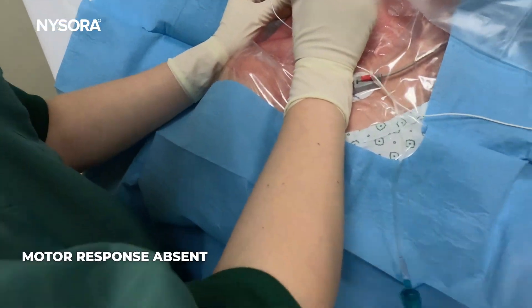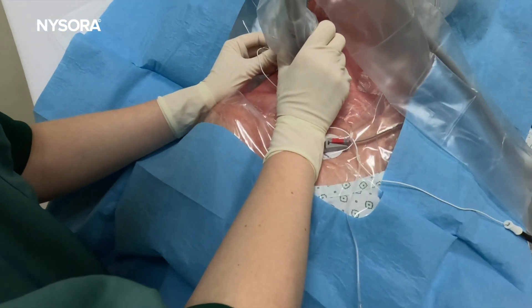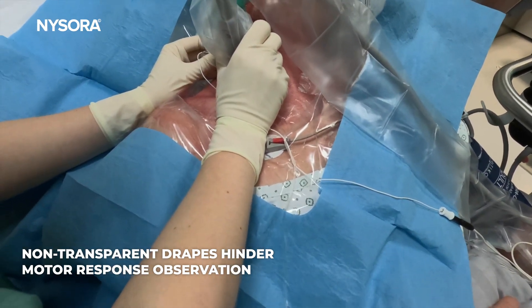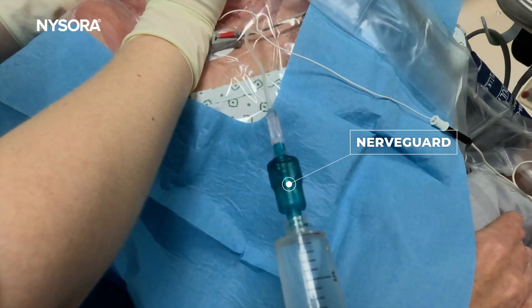At 0.5 milliamps, we don't have a motor response here, which is very important. Unfortunately, all of these drapes are not transparent, therefore preventing us from actually seeing the motor responses if they occur, so I have to be super careful. And that's the nerve guard that we are testing out.